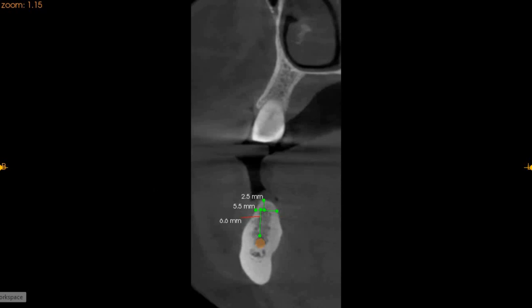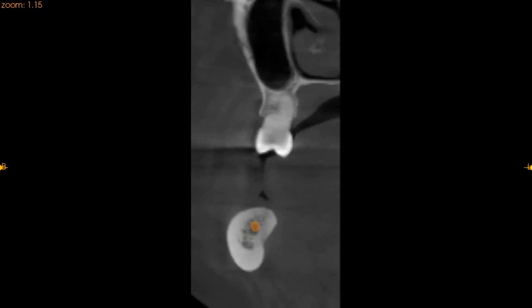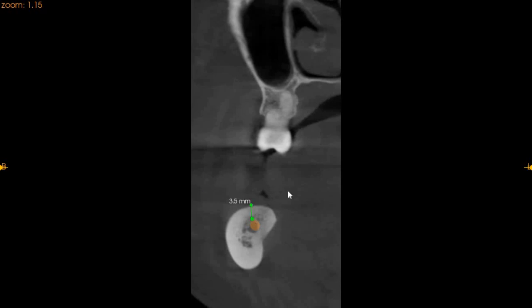The second molar region is slightly more complicated. Here we unfortunately have little to no bone height — just 3.5 millimeters of bone height — but we do have 9 millimeters of ridge width. If you want to place an implant, the cortical plate up to the inferior alveolar nerve gives approximately 5 millimeters of width space, and a good length implant can also be placed in the buccal cortical plate on the lower right second molar region.